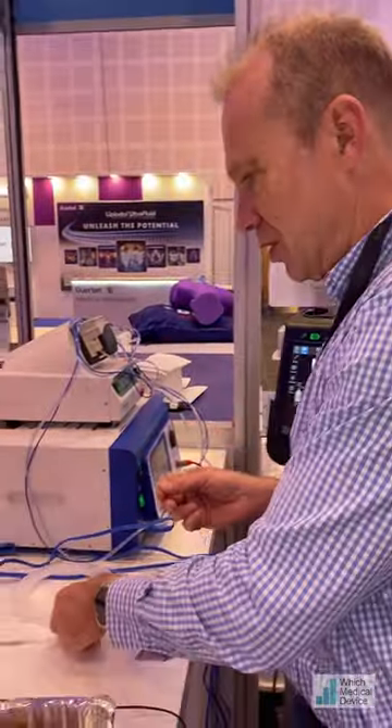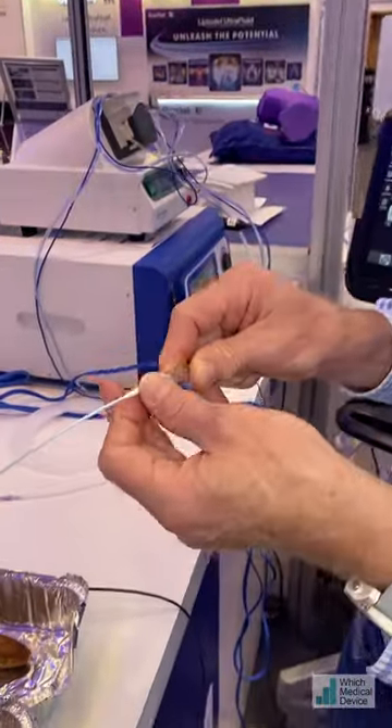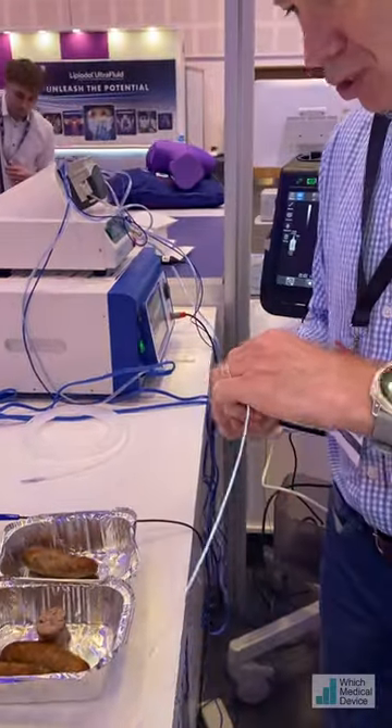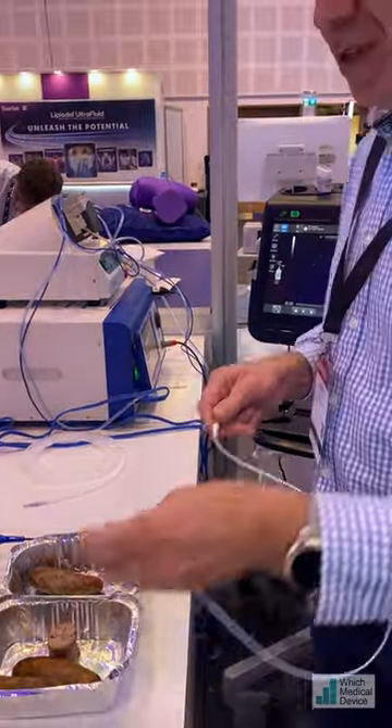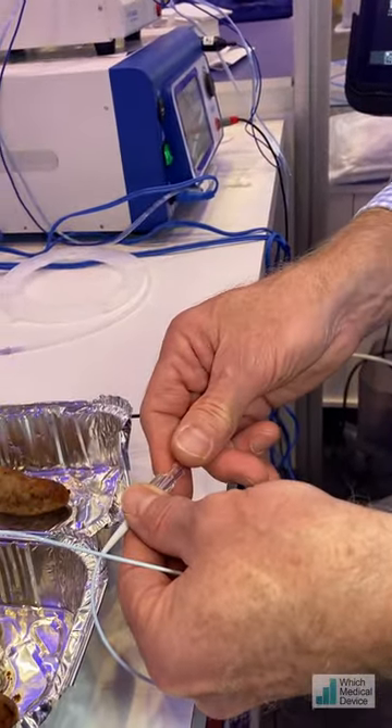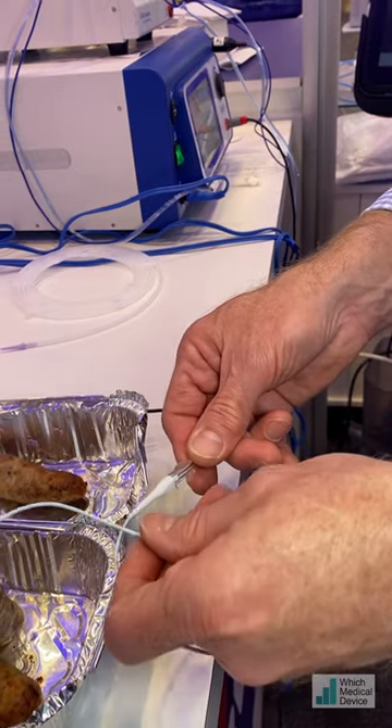There's a little angled one and also a straight one. It's relatively flexible — you can put this through an angled catheter. I'll just demonstrate that: this is 0.035 inches in diameter, so if we put it all the way through this catheter here, you can see the catheter will still maintain most of its angle.